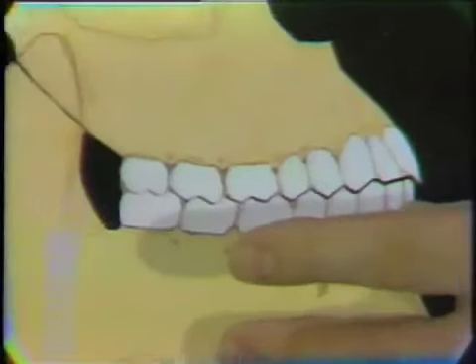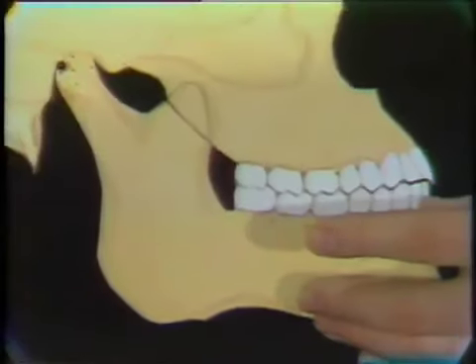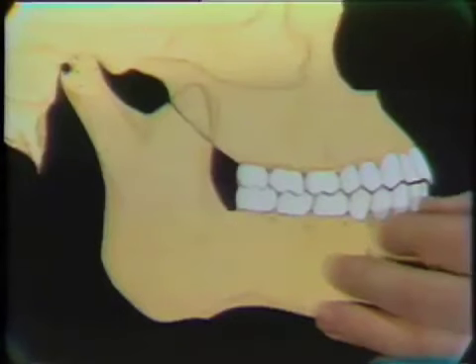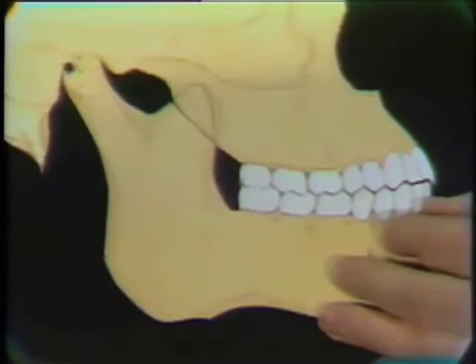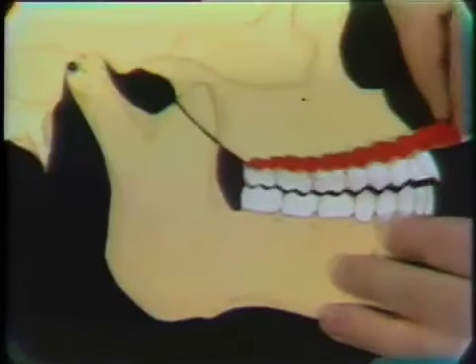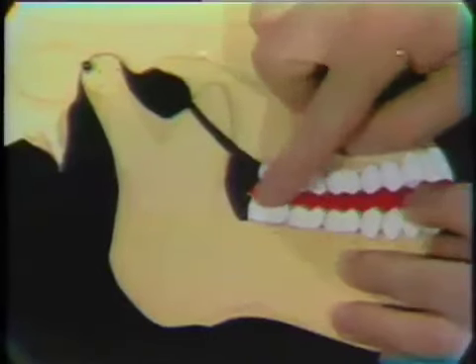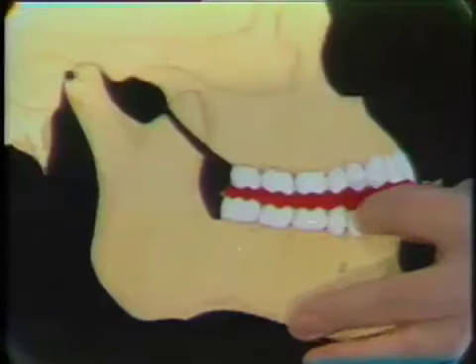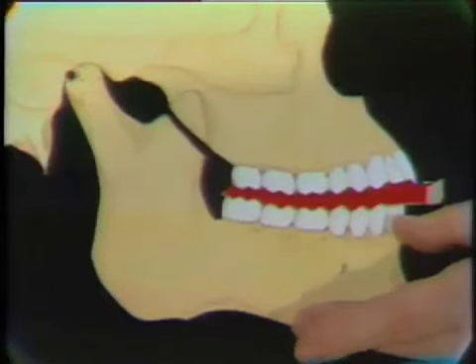So if we err in the location or we use the wrong axis on the articulator, the teeth will not close into contact the same way as they do in the mouth. So an error in locating the axis can cause an error in the contacts between the teeth when we go to the mouth.